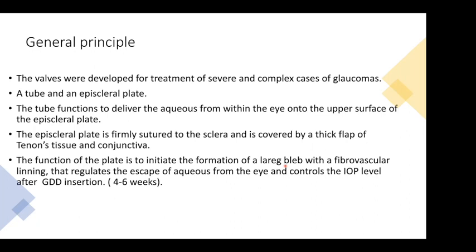The general principle of a valve is that valves are generally developed for the treatment of complex cases of glaucomas.